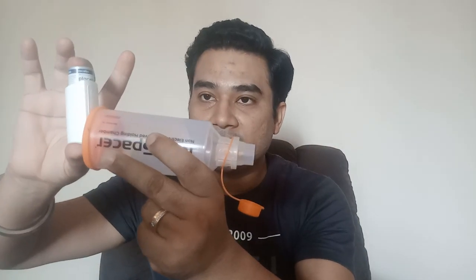Now I'll demonstrate it sideways, so it is easy for you to understand. Now coming to the demonstration part. See, I will press it once and inhale, exhale five times for one press. One press, and inhale, exhale five times. So here this contains a valve. When you inhale, this valve opens, and when you exhale, this valve closes, and the air comes out of this. So you don't have to worry about this. The only thing is, press this once, inhale, exhale five times. You press this, you inhale, you exhale. This is like this five times.